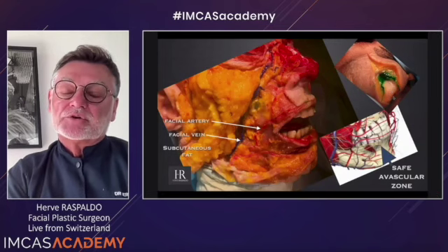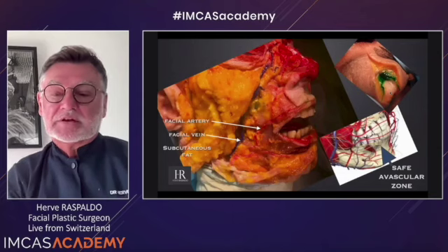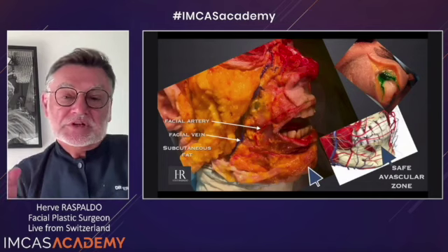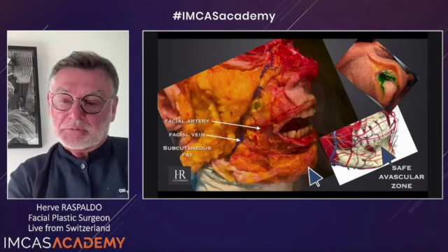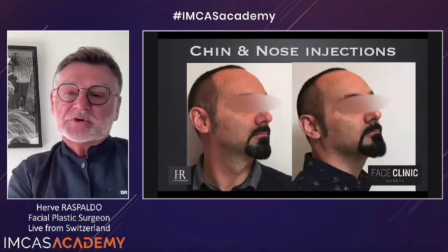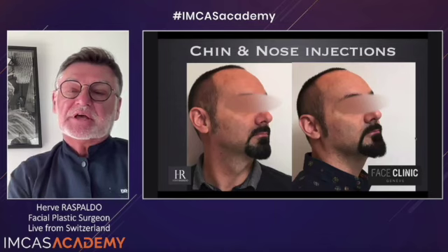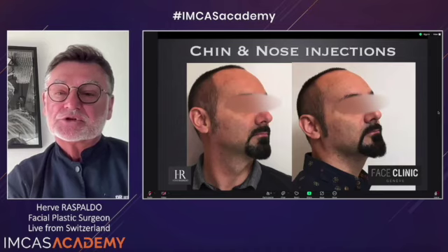If you inject under the chin, of course, it's dangerous. If you inject lateral, it's dangerous. But down to the bone, if you want to aspirate, you can. Then this is a safe injection and very simple. And you don't absolutely need a long tool like a cannula to do this bolus or this pyramid. A needle is enough or a short cannula. So have a look at the result with 2 cc of double XL. You see the projection of this chin. And to be honest, and this is the transition, he also had an injection on the bridge of the nose. So that was the L lift for the jawline.